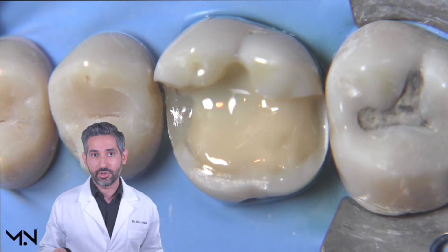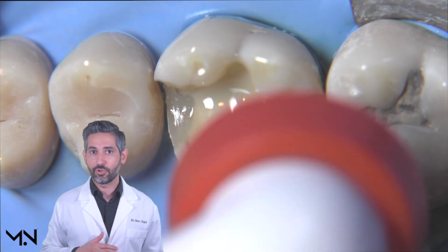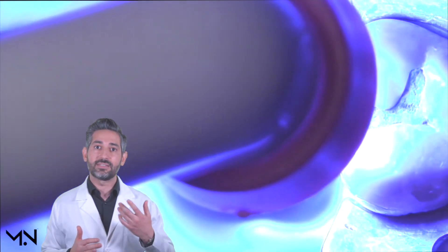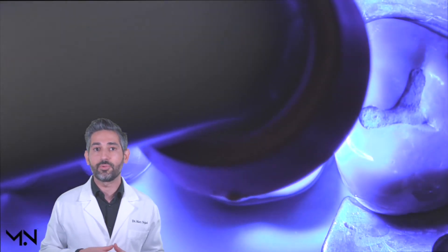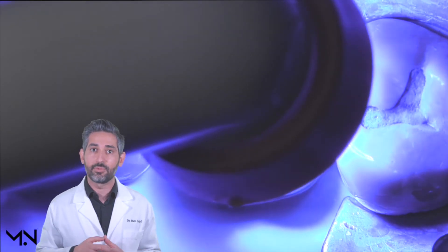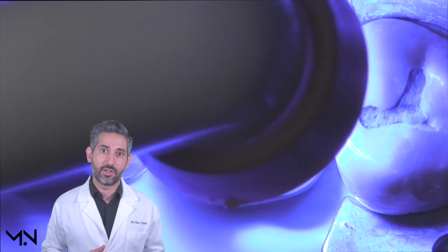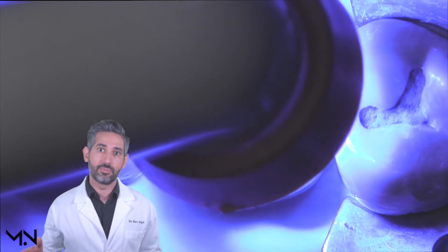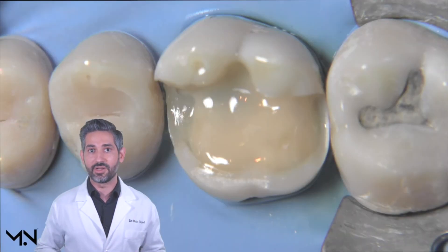While you're curing again, the bond is still forming to your dentin. What's nice about the flowable resin is that it has a lower modulus of elasticity than the following products we'll use, and it allows the bond to continue forming without excessive stress that would minimize bond strength to dentin. It also protects the developing dentin bond from subsequent layers, depending on the shape and configuration of your preparation.